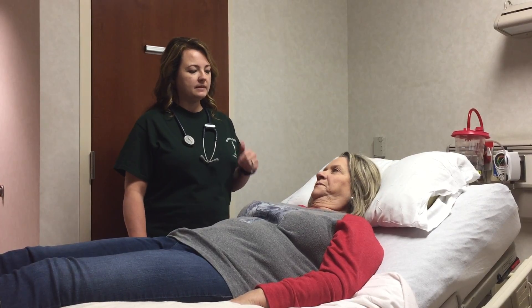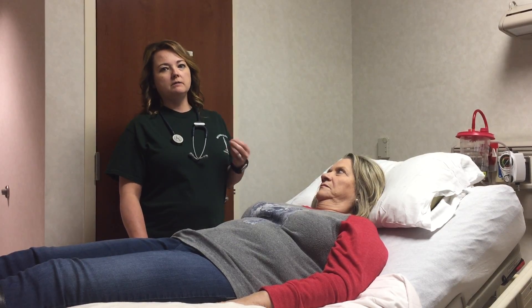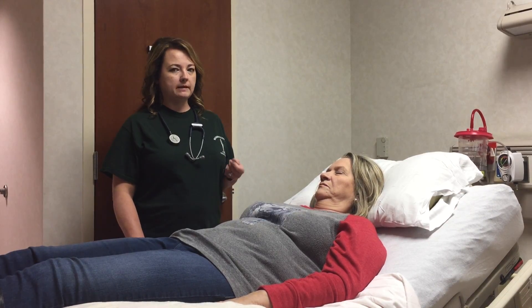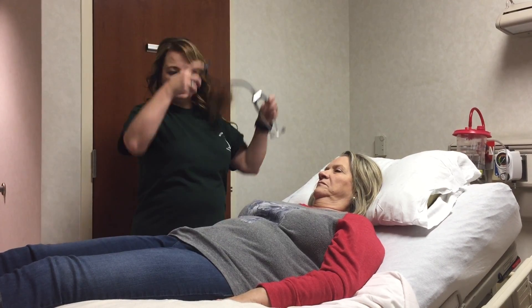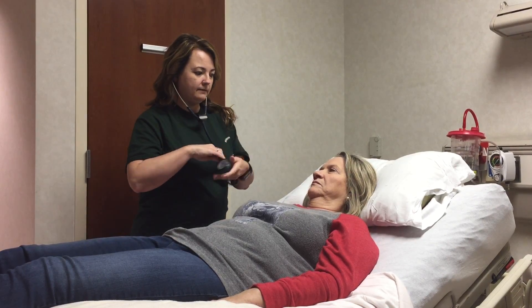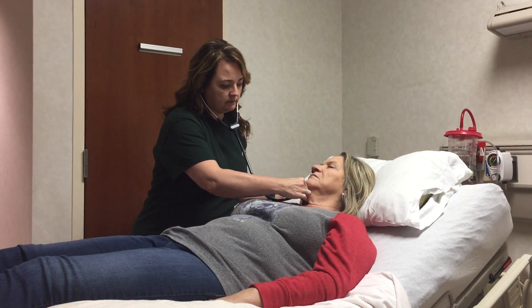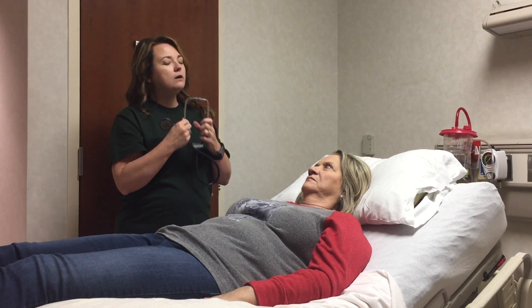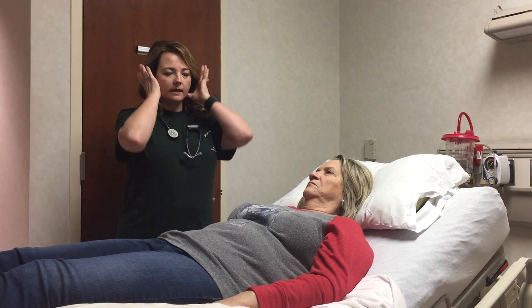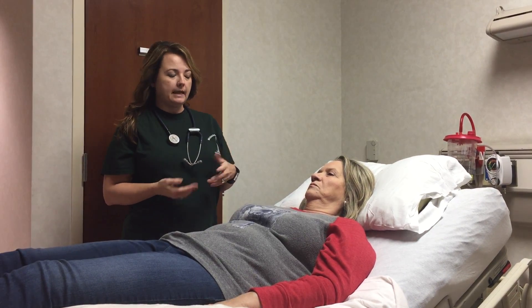The next thing I'm going to do is auscultate the carotid artery. You need to always auscultate before you palpate, because by palpating you can disrupt the rhythm and cause abnormals that may not truly be there. To do this, I will use the bell of my stethoscope. Ms. Billy, if you would please hold your breath for me. By holding her breath, that keeps the breath sounds from occluding the actual sounds of the carotid. What I'm listening for is a bruit, which would be an abnormal sound.